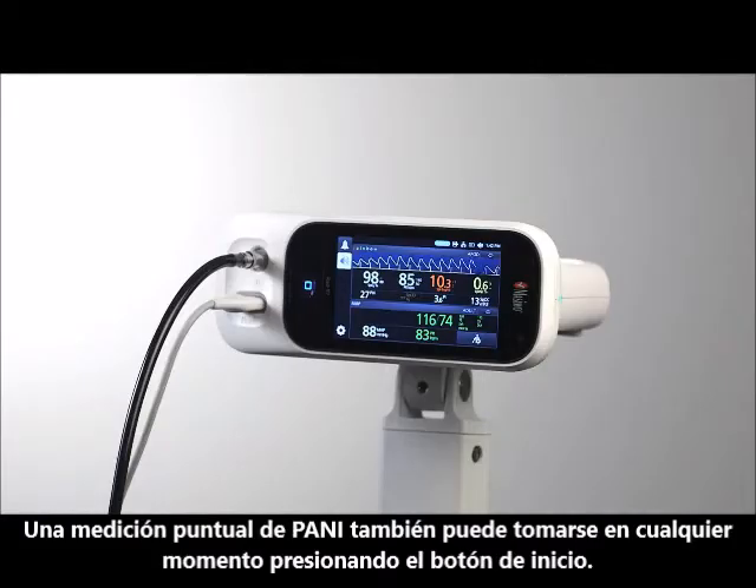A Spot Check NIBP measurement can also be taken at any time by pressing the Start button.